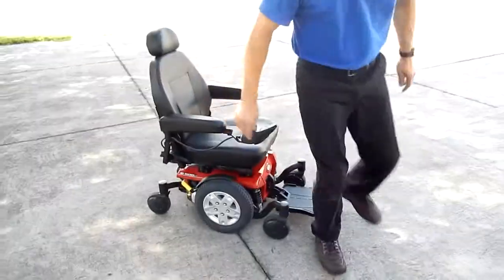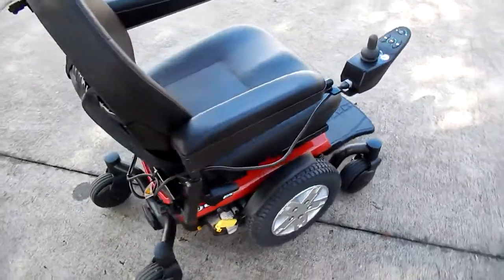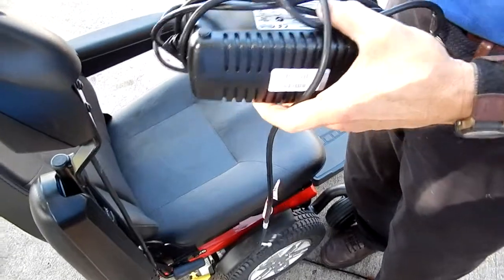This chair has a very smooth ride. If you need to charge this chair, the only thing you have to do is take your charger that comes with the chair, move your joystick up in the air, and plug it right in the back right here. When your chair is full, you're ready to go.